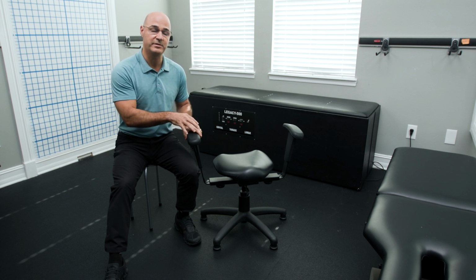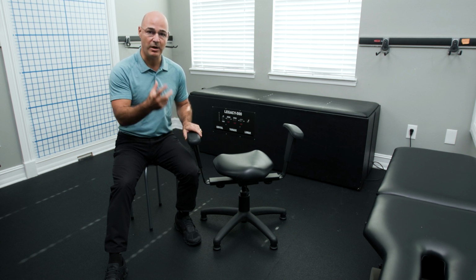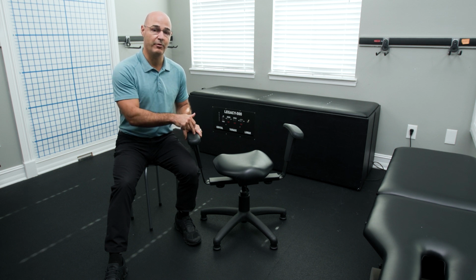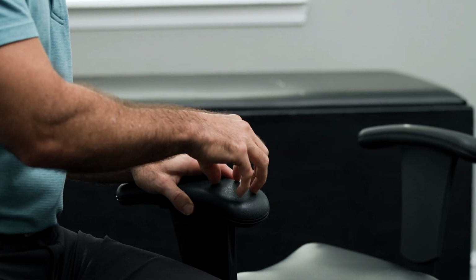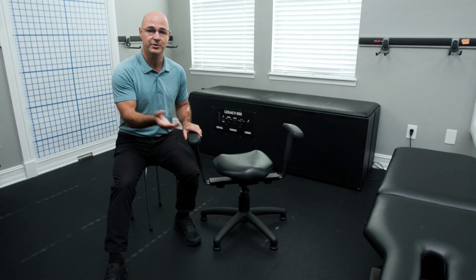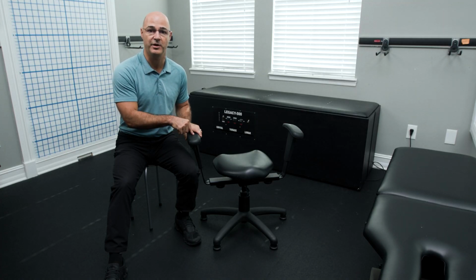What the Wobble Chair allows us to do is to help rehydrate and remodel those discs into a better position by first warming them up. And this kind of sets us up for our future therapy and rehab that we'll be doing in the clinic. So the wobble exercise can be performed very specifically to help increase disc flexibility, and then it can also be utilized in specific curve patterns, which we're going to see in a second. So let's go ahead and demonstrate how the Wobble Chair will actually function.